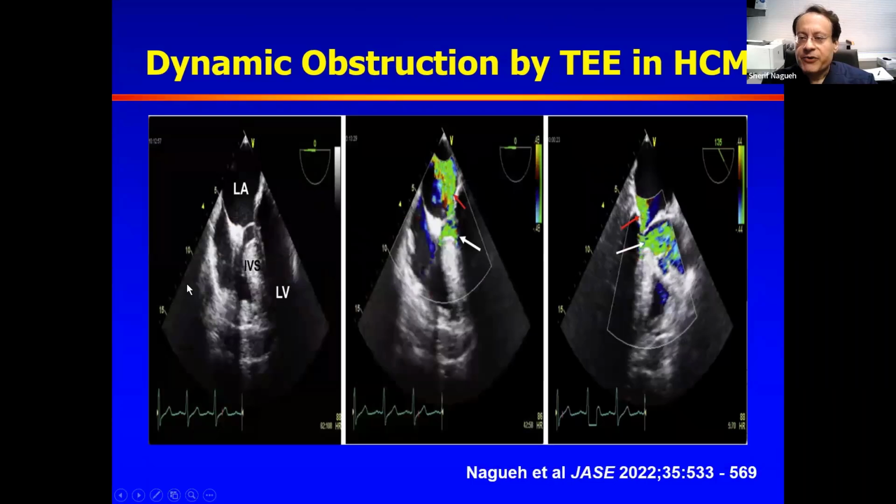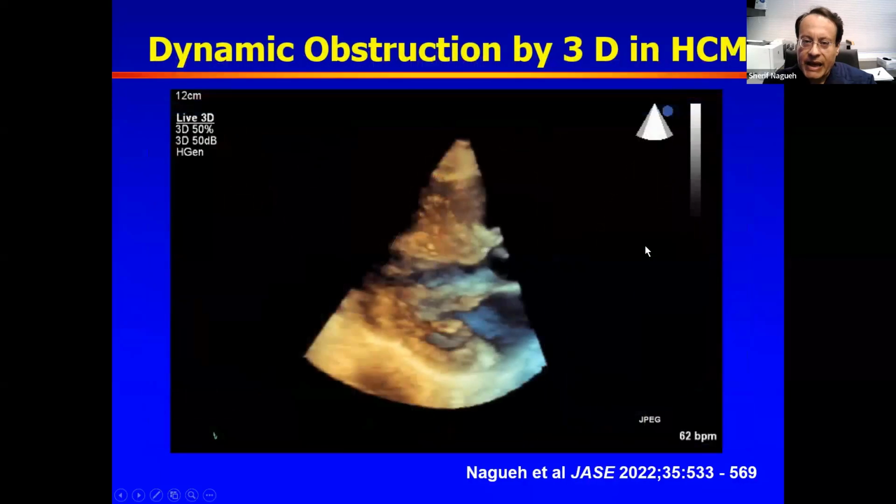Do you need transesophageal echocardiography? Not really, to look for dynamic obstruction. This is more applicable in the OR setting, or if you are doing a case where you're going for percutaneous plication of the mitral valve, catheter edge-to-edge repair. In patients who do not have much of an increased wall thickness, again, you see the acceleration into the outflow tract and the mitral regurgitation jet in 5-chamber and long axis views.